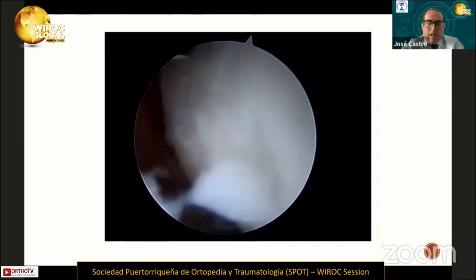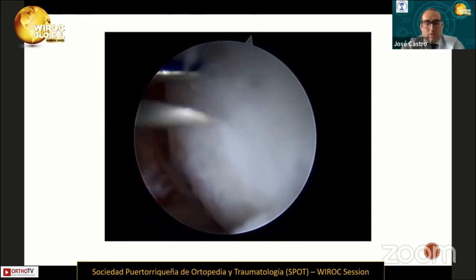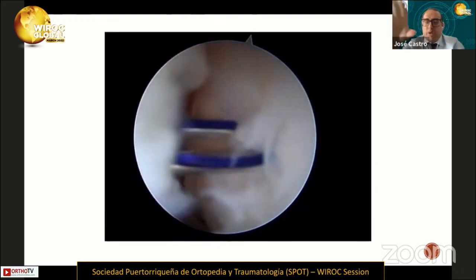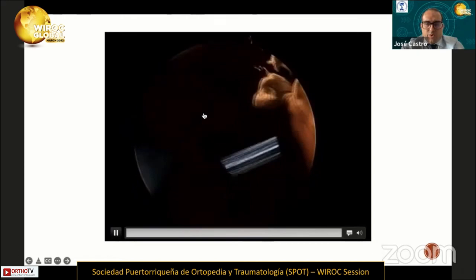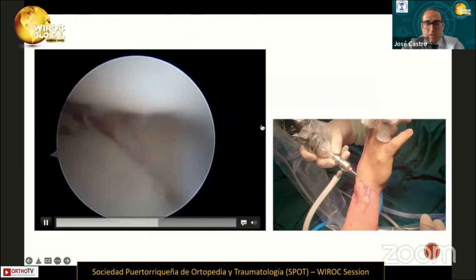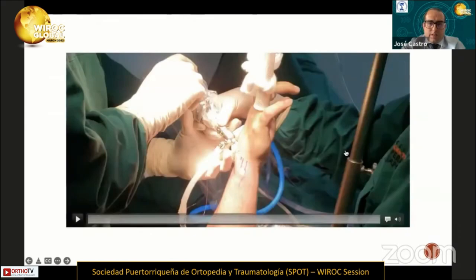After that, we started to perform the arthroscopic dorsal repair. We passed the sutures through the dorsal capsule and then through the dorsal portion of the scapholunate ligament, as you can see in the video. We used only PDS sutures with needle number 21. After that, we retrieved the sutures in the midcarpal space.